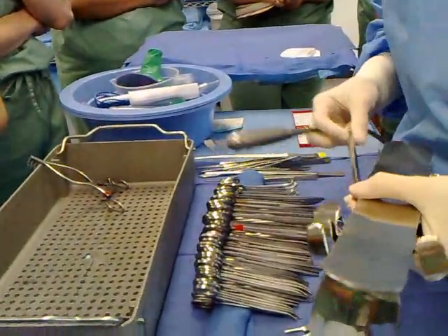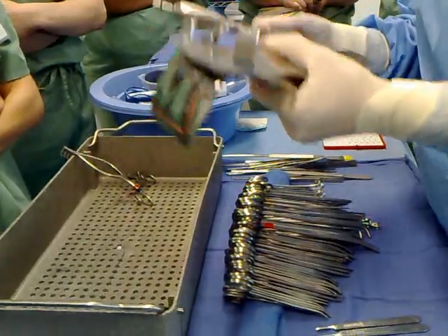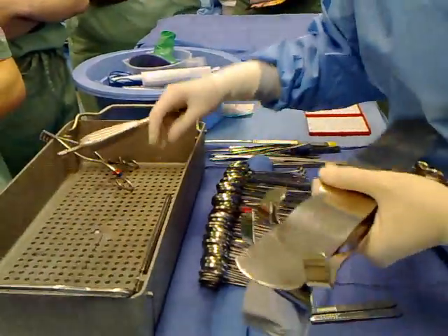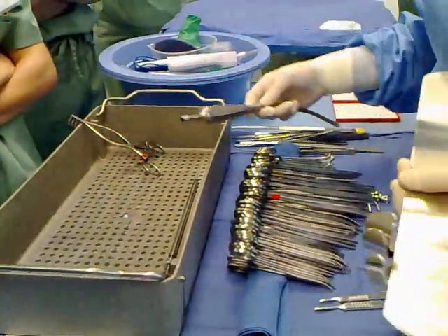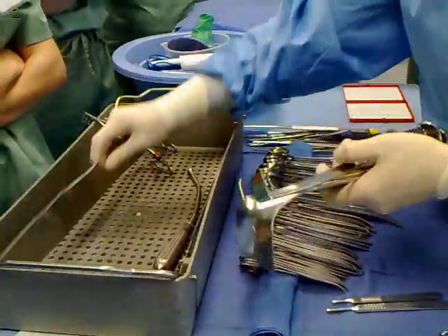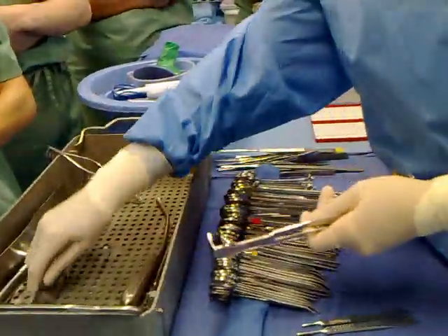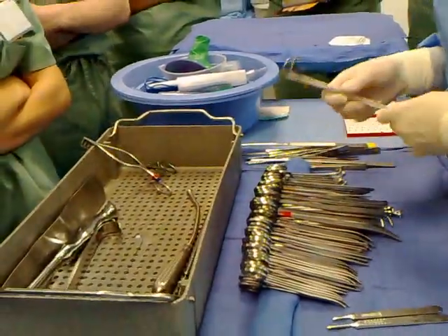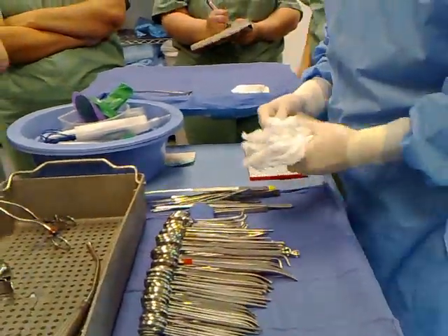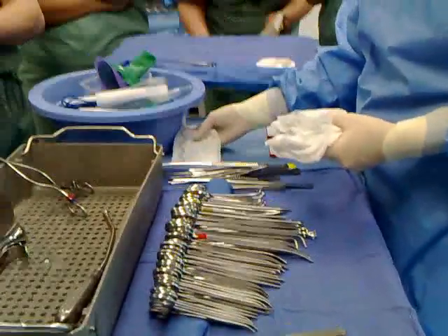Remember, the suctions are always supposed to be apart. You keep putting them together, but they need to be apart — even just a little. You aren't allowed to have them together; you get yelled at. They have to be separated — one of the two ways. After the instruments, what's next? Sponges — all sponges.